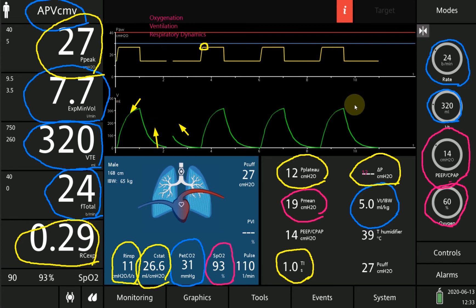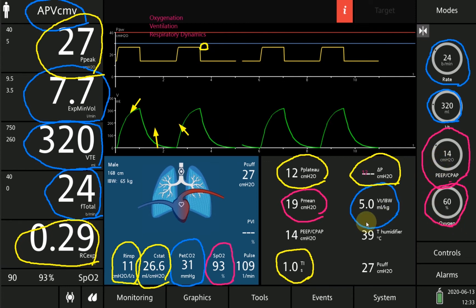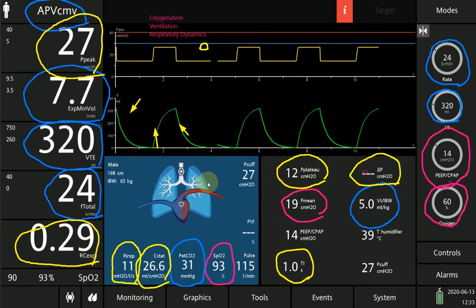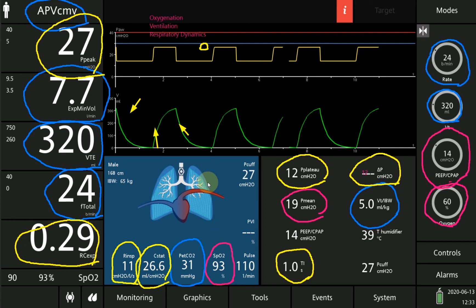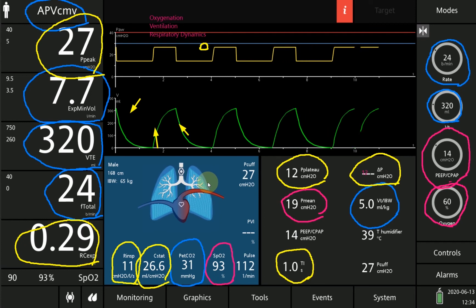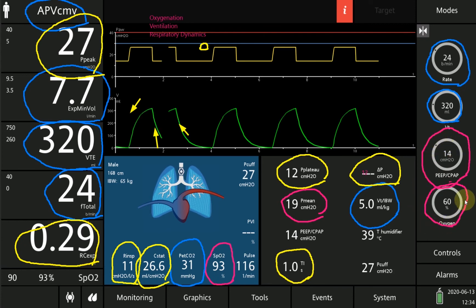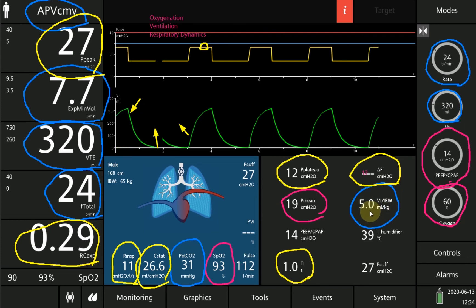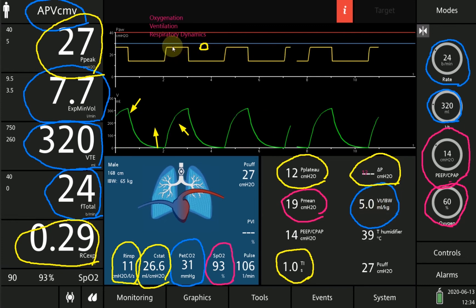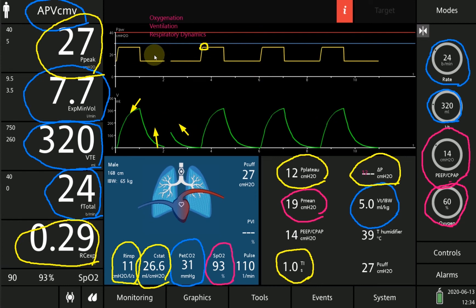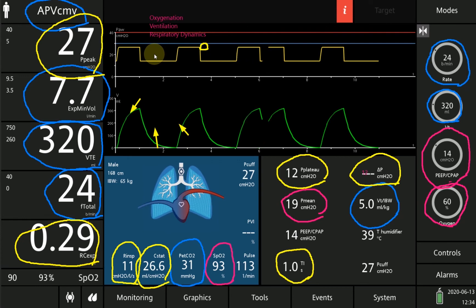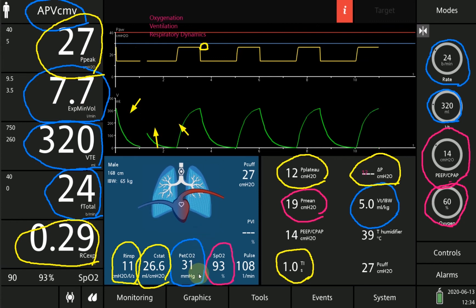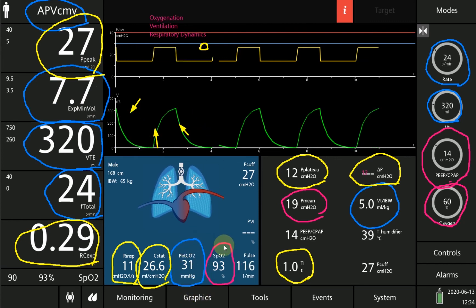On this screen, oxygenation is depicted in red, ventilation in blue, and respiratory dynamics in yellow. The parameters set for this patient are within a protective lung strategy: he has adequate PEEP for his FiO2 level, tidal volume within 4 to 6 ml per kg ideal body weight, plateau pressure well below 30 cm H₂O, driving pressure well below 15 cm H₂O, and minute ventilation appropriate for his metabolic rate as evidenced by a normal end-tidal CO2.